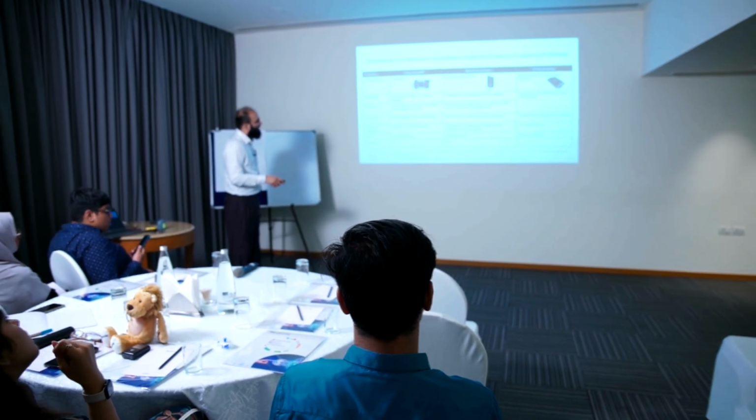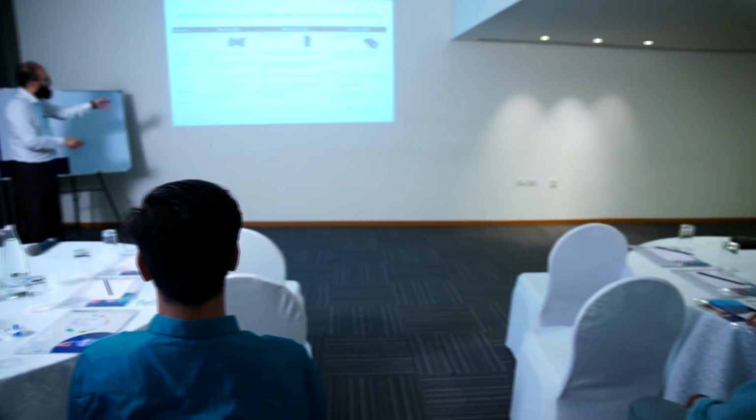SmartGuard HCL technology: threshold suspend, predictive low glucose suspend. It has this inbuilt feature, and yes, control to target is what it does. CGM, the sensor is Dexcom G4 sensor in this Animas Vibe. Here it is Guardian sensor. Now we use Guardian sensor 4. And here it is Dexcom G4 Platinum.